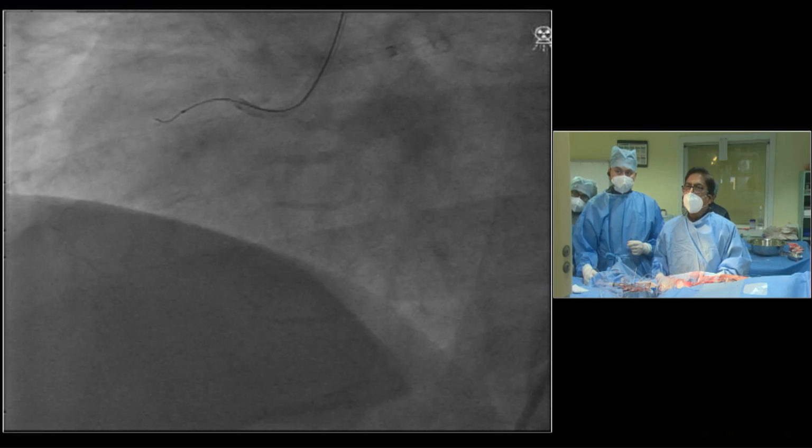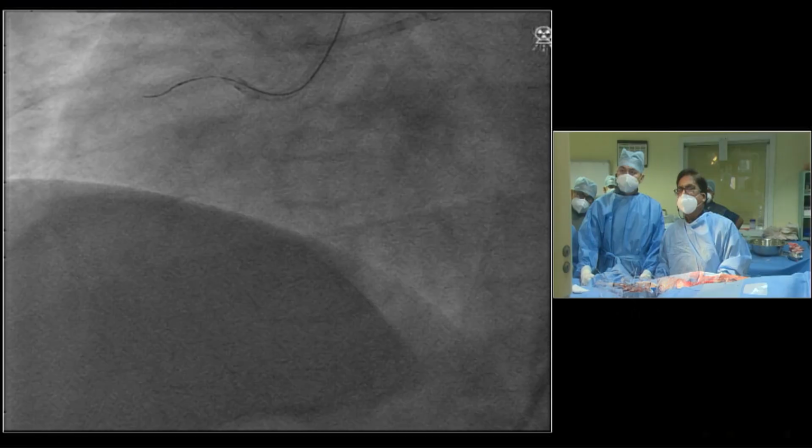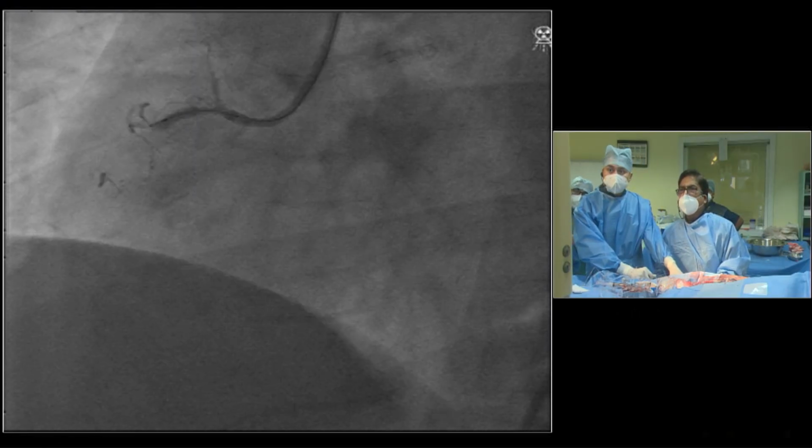Can you show the angiogram images? Can you show me the angio, please? Angio injection. Be ready. The idea would be I've gone directly with the Dia wire.